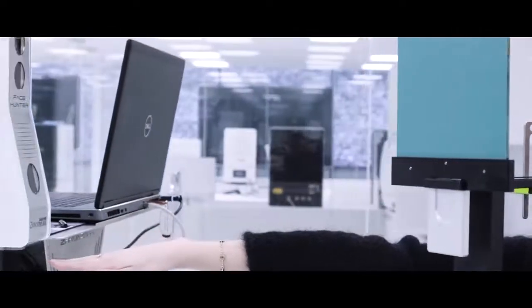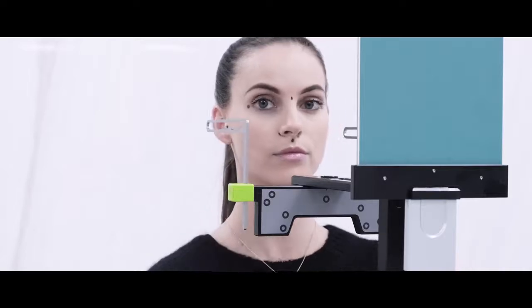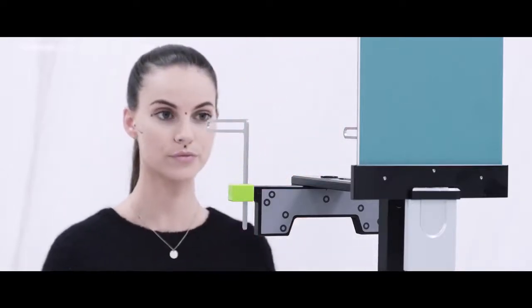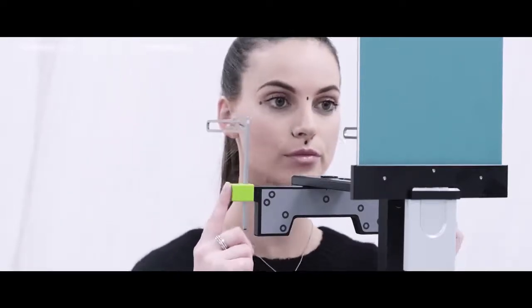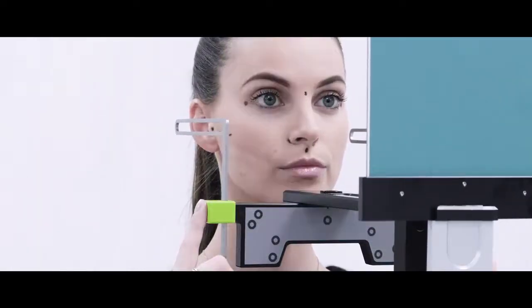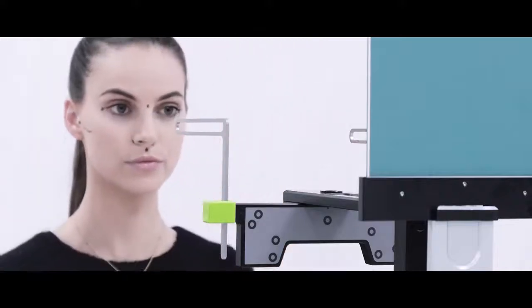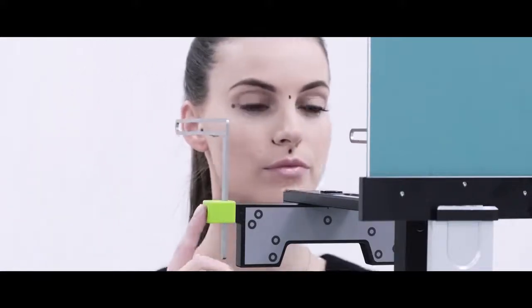The patient positions herself at a distance of about 70 centimeters from the FaceHunter and looks into her eyes in the mirror. In this way, she will spontaneously adopt her natural position. At this point, the dentist proceeds with the scans. Between the scans, the patient moves away from the plane finder and gets back in front of it. This operation is repeated for a minimum of 3 times.